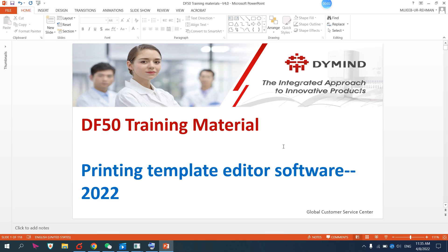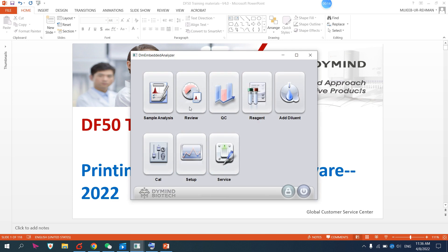Hello everyone. Today I'm going to show you how to use the printing template editor software for the DF50 and D36 analyzers. The process is the same for both. I have the DF50 demo software, so I will show you using DF50.